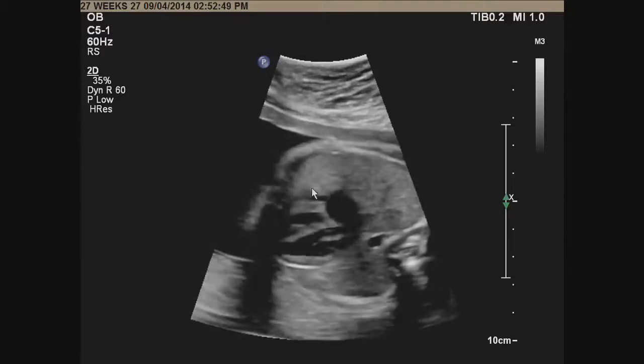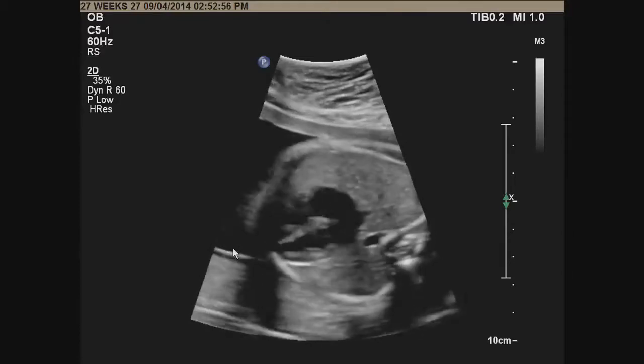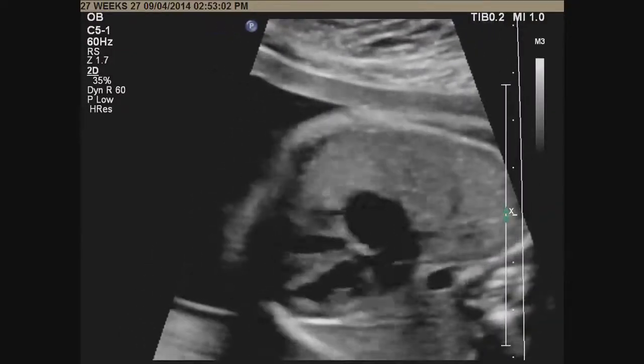Then I'm going to look at the right ventricle here. See that the border is more coarse. Now before, maybe we can, why don't you magnify? Just going to go in. Yeah, okay, let's do that for now. Oops, sorry. Let me get the pointer back again.